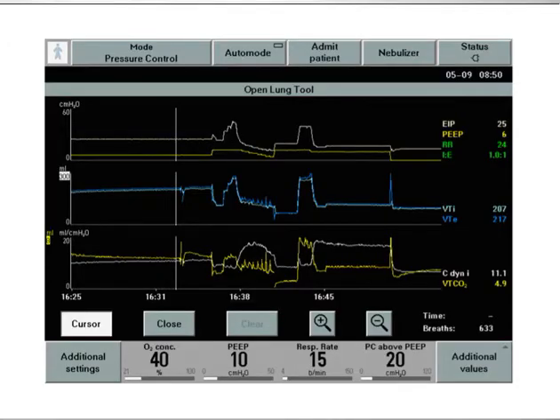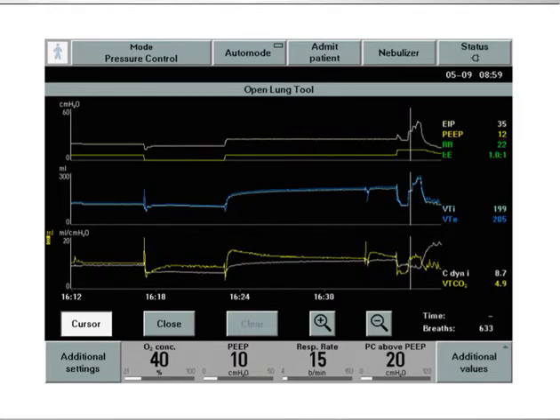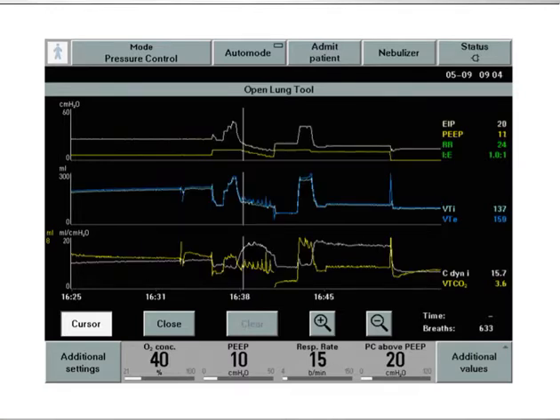And now I will try to take you through how it looks on the screen when we do this. We start with a baseline ventilation and move into the recruitment. We increase the positive end expiratory pressure, and we increase to 35, 40, and 45 during the recruitment maneuver, and goes further down now doing the PEEP titration. And we see now the compliance curve, which seems to be at this top and then going down. And now we are at 7, and we were at 8 there.